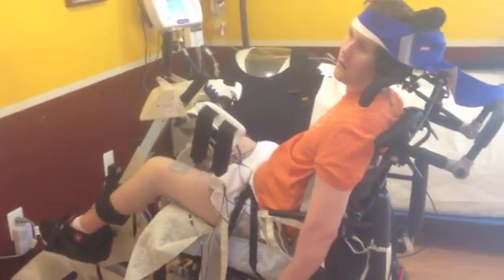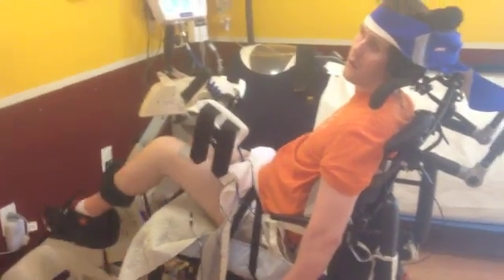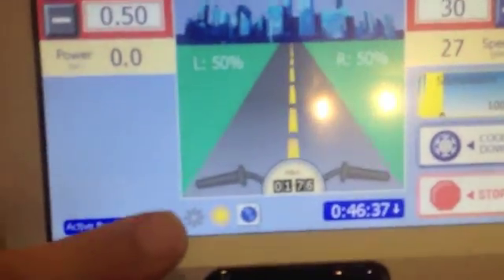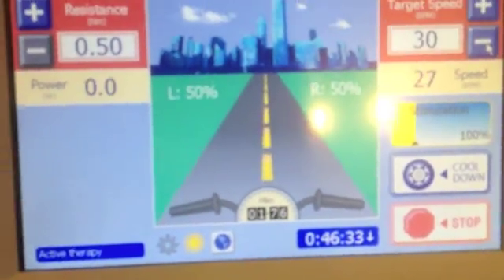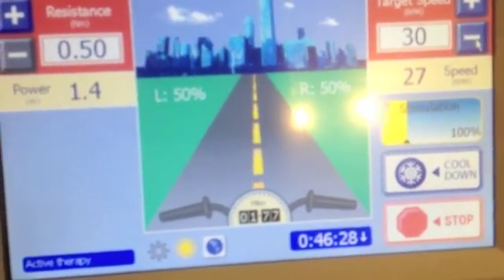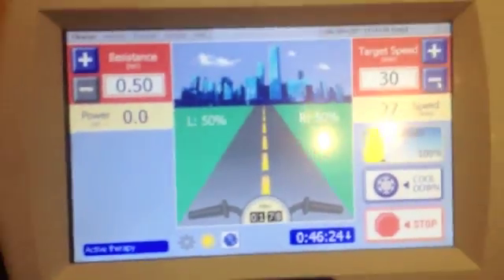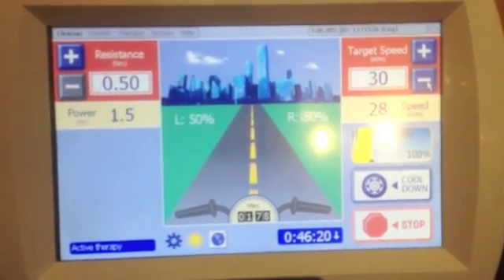Ryan is working out on the therapy equipment with electrical stimulation, currently doing his legs. If you watch the gear, when it's shaded gray, his muscles are doing the work. If it's blue, that means the motor is assisting him. Right now his muscles are doing the work, and now they're not.